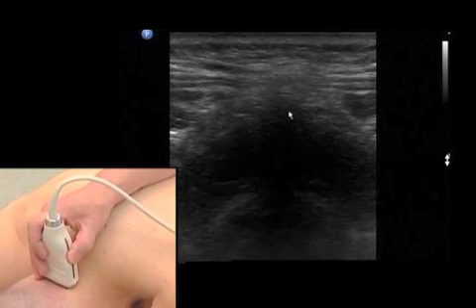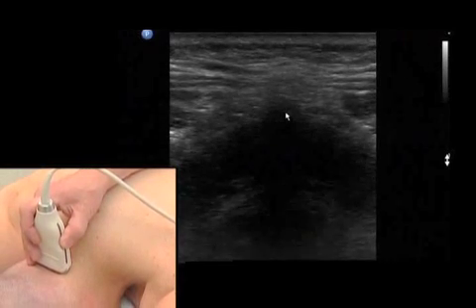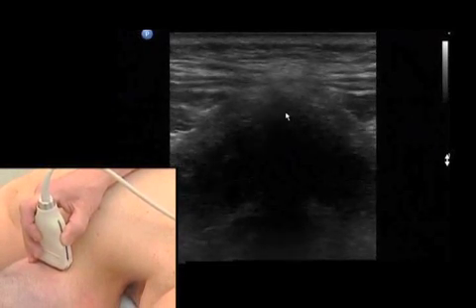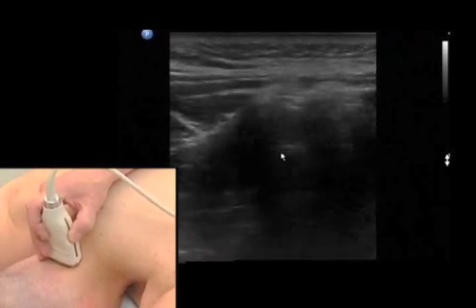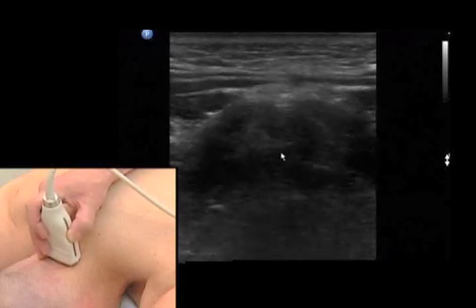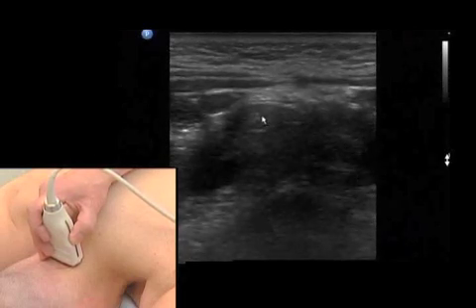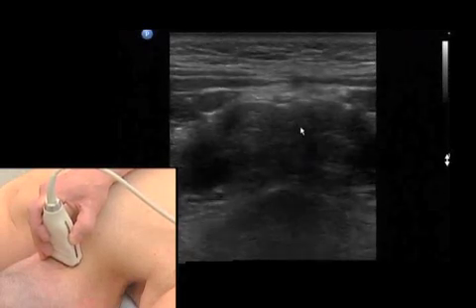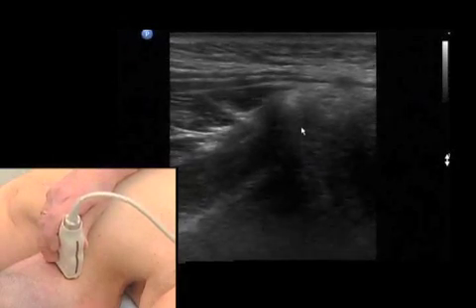There's no spinous process at the atlas, which is very characteristic. And if you move the probe further down, you will see that the spinous process of the axis has two prominent tubercles, a left and a right, and from here we move the probe laterally.